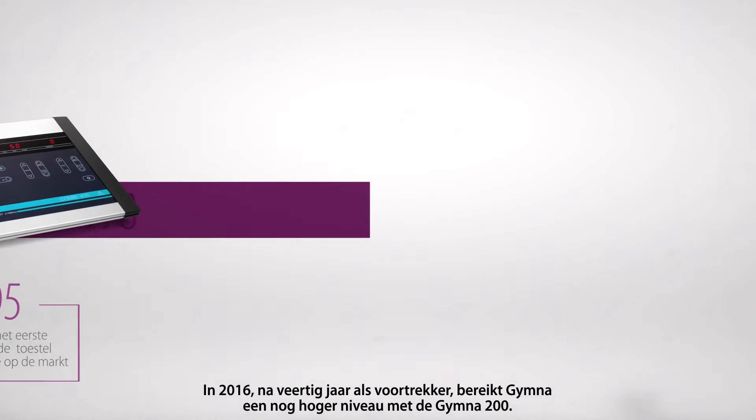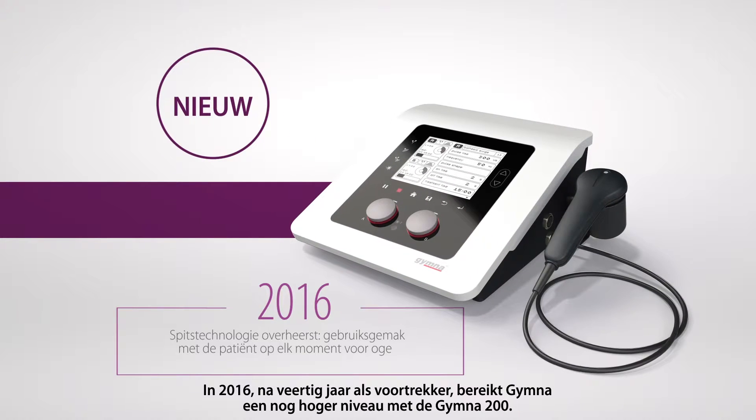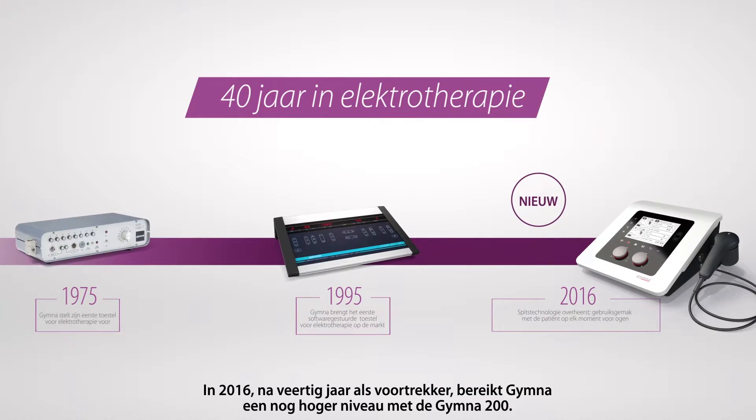Now in 2016, after 40 years at the edge of progress and evolution, GYMNA reaches yet another level of excellence with the GYMNA 200.